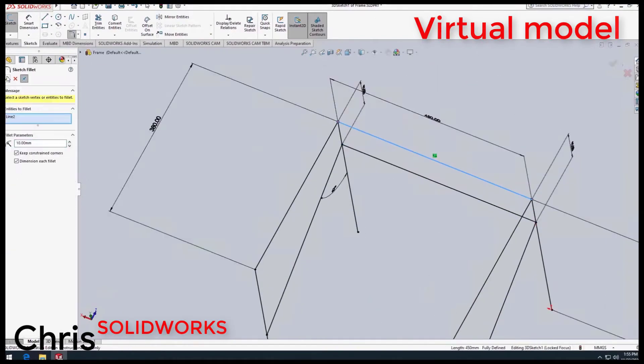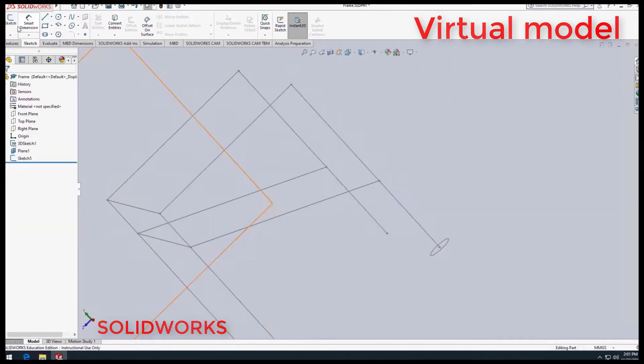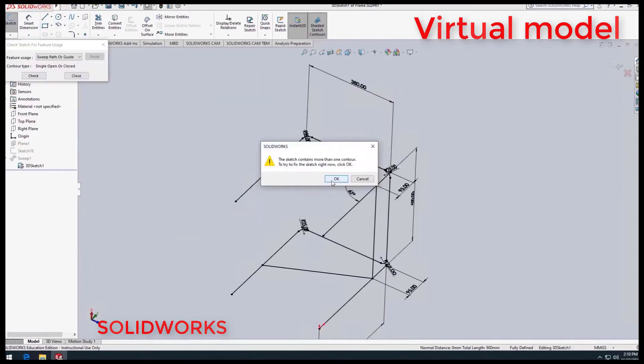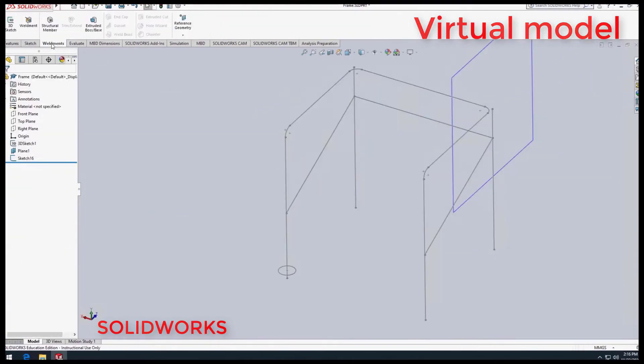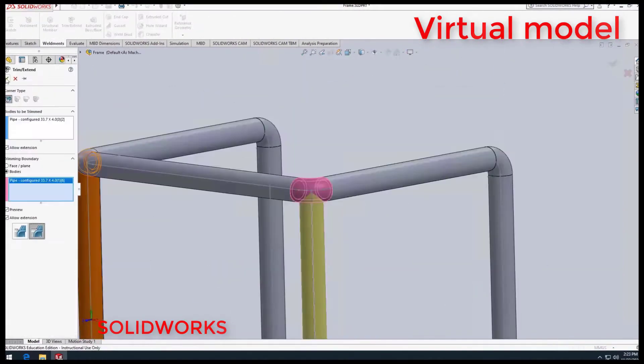After we finished the low fidelity prototype, we moved into SOLIDWORKS, where we would convert the low fidelity prototype to a high fidelity prototype. From there we could really see the design come to life, as we could now see it in 3D and make changes to the design in a faster, more streamlined fashion.